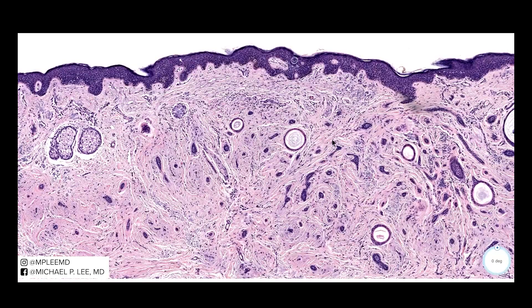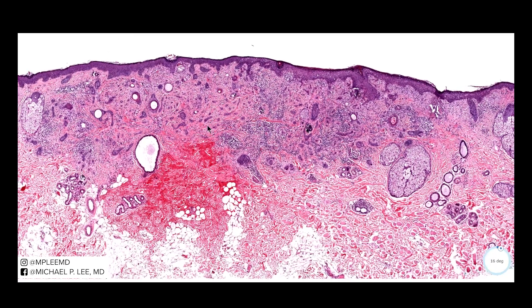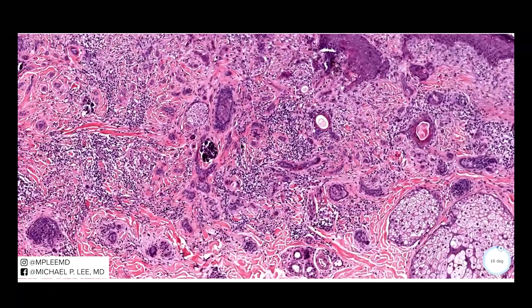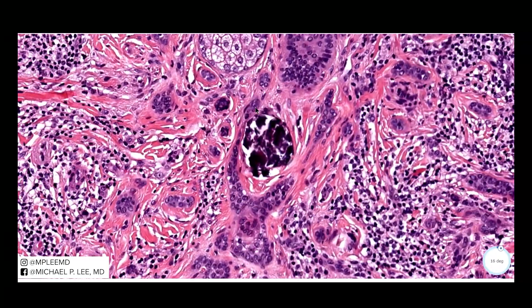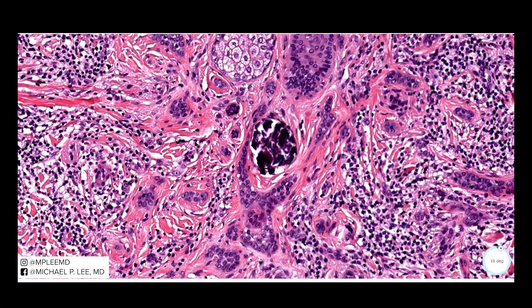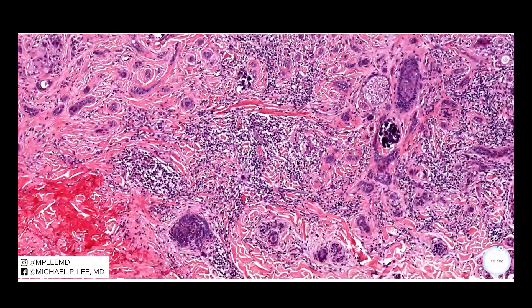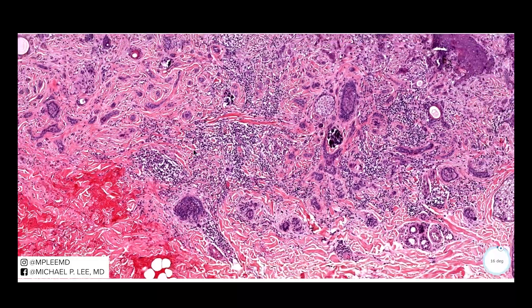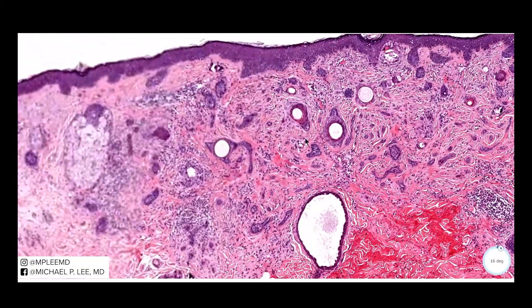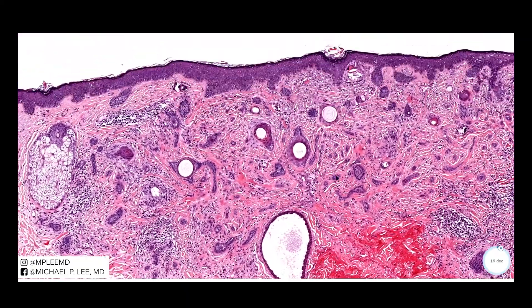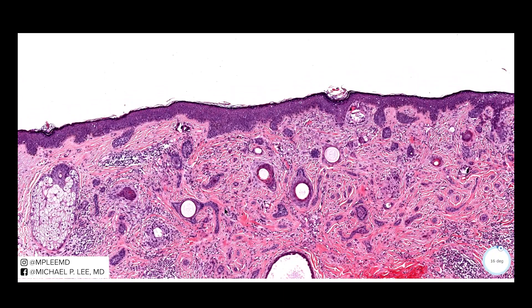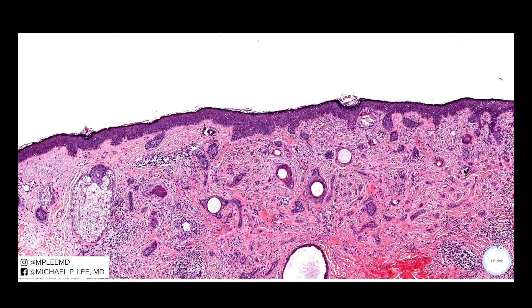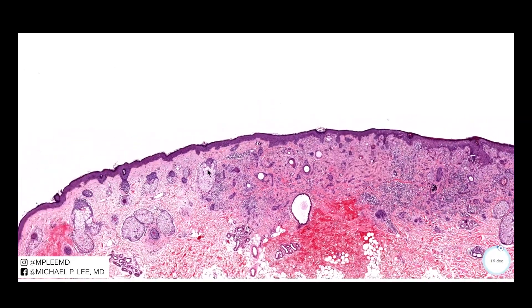Here's just another example. More pronounced calcifications here, and actually some inflammation, probably because some of the horn pseudocysts had prior rupture — and that's why it's pretty fibrotic here as well. Numerous microcysts, some of them even looking like syringoid or eccrine ductal differentiation. But overall, very well circumscribed, not penetrating deeply, and generally in a younger person.